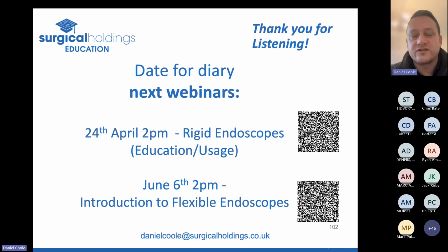In my opinion, if you're interfering with the surface of the steel, devices should be repassivated, because you are then risking disturbing the steel, releasing free iron, etc. But I'm happy to give some more information on that. Obviously, I can't speak for other companies, but we do it and it's important.